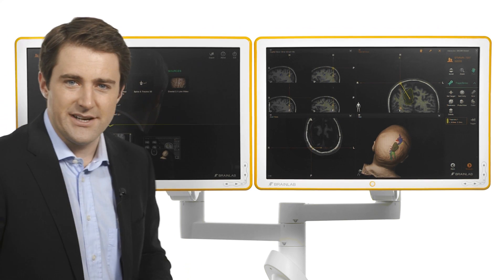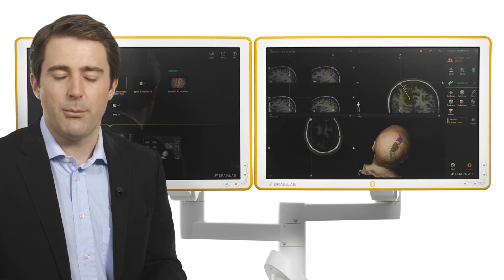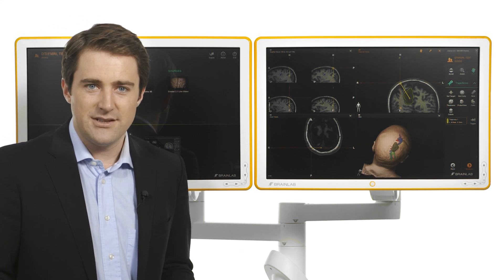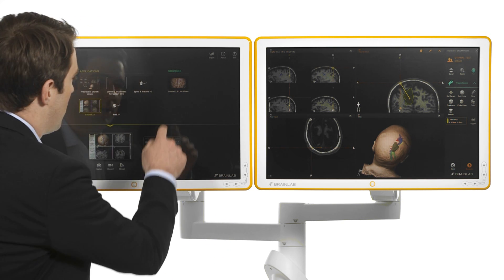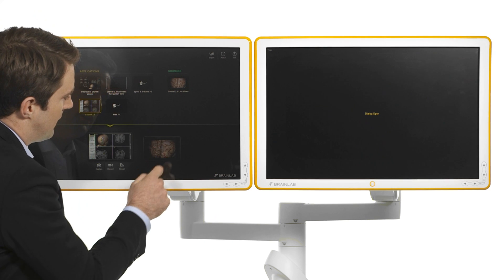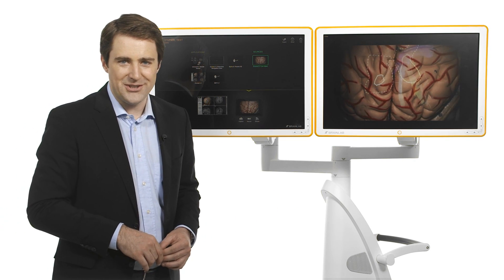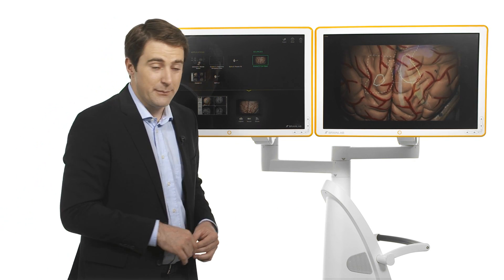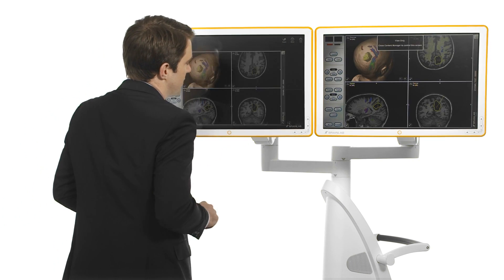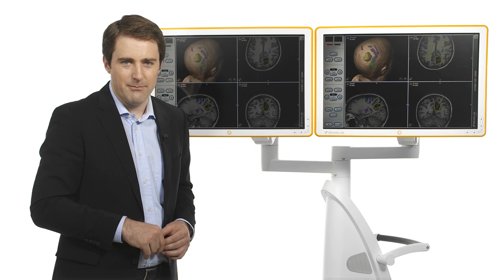From the start screen, a connected video source such as an endoscope or microscope can be selected to be displayed full screen on one monitor. Of course, both screens can also display the same information in cases in which one monitor is facing the surgeon and the other one is facing the non-sterile team.